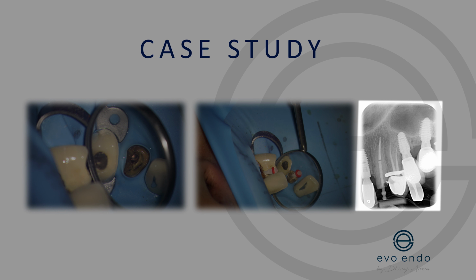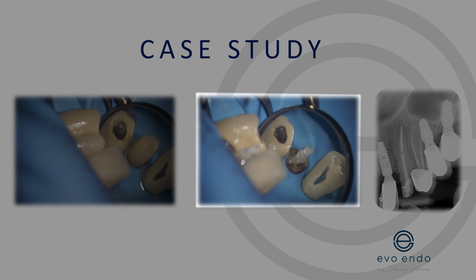Once we've done that, it's as simple as preparing it with your post drills. Once prepared with your post drills, I would always, especially early on in your careers, take check x-rays with the post in place to make sure it's appropriately directed and to the correct length. Once I've done that, I'm happy. And then it fundamentally comes down to your bonding protocols.